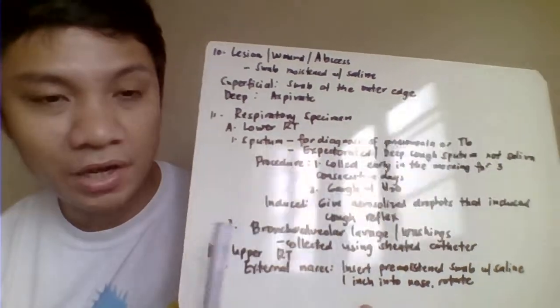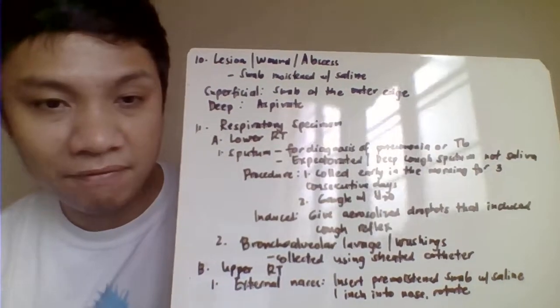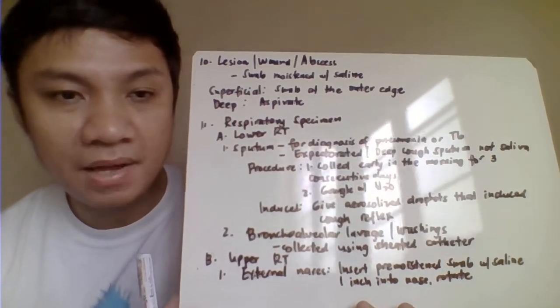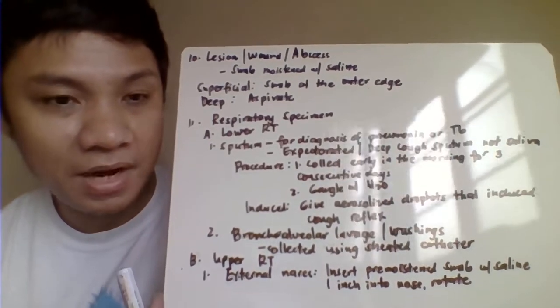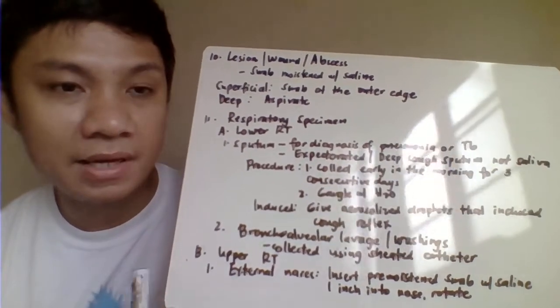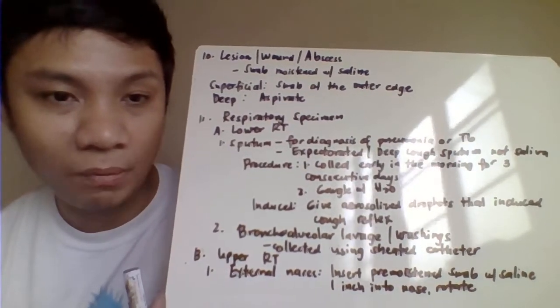So you can collect the sputum here through your expectorated or deep cough. You can perform here your sputum collection by your deep expectorated cough. So the procedure for that, it is being collected early in the morning. So as soon as the patient arises from sleep, the patient will just be instructed to gargle with water.